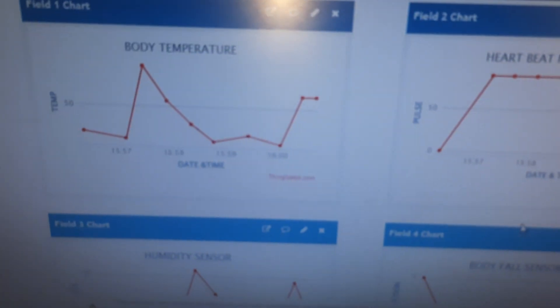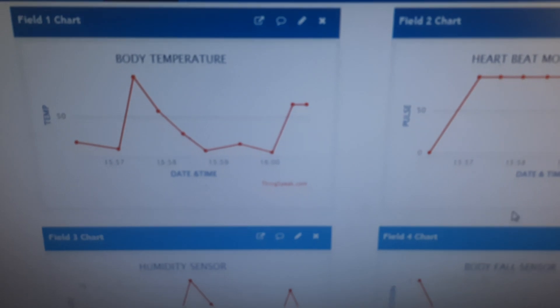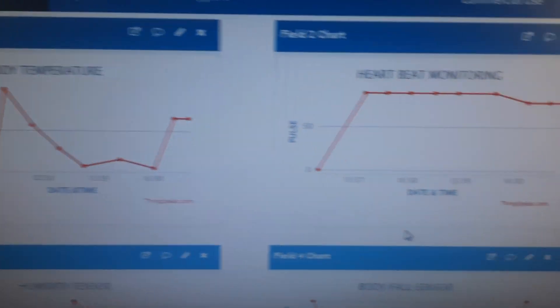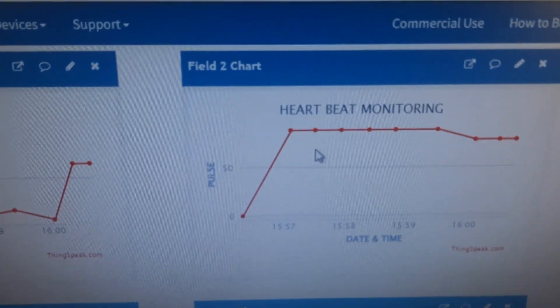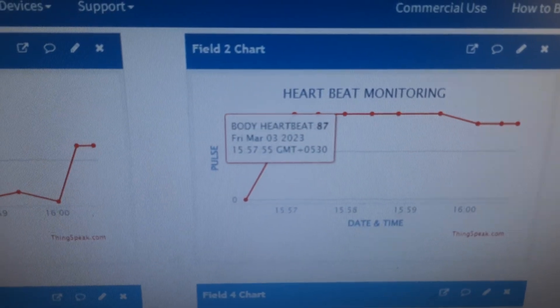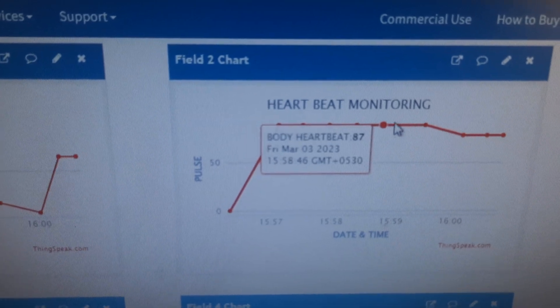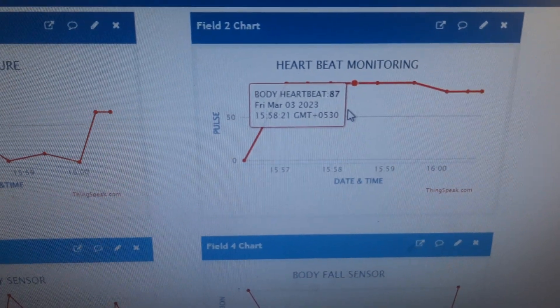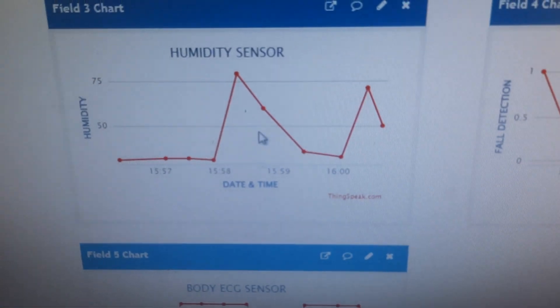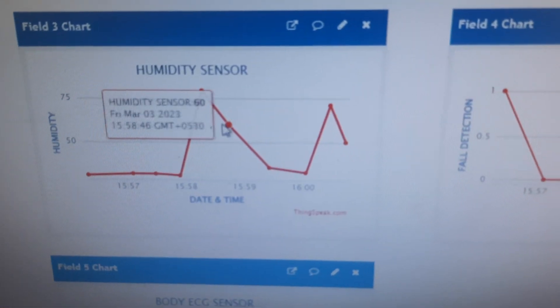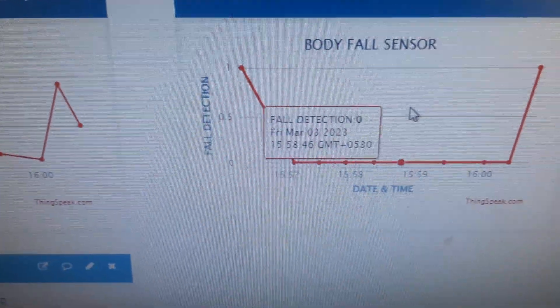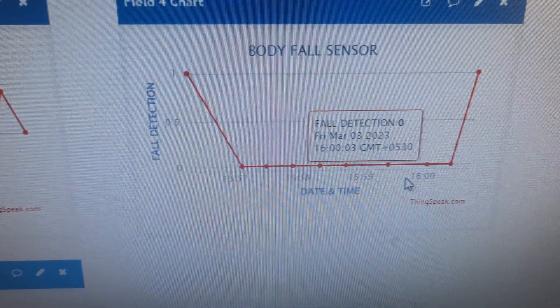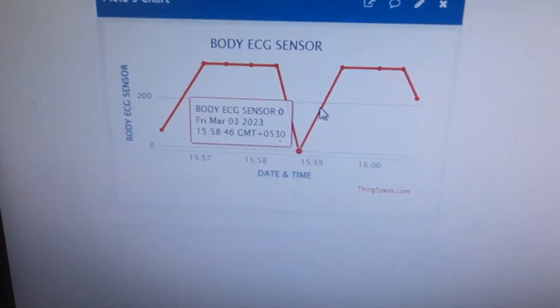We are getting the data onto the ThingSpeak cloud. LM35 temperature sensor, heartbeat sensor - we are getting the values like 87 for heartbeat value. Then humidity - whenever we are giving the humidity, the humidity value will come with date and time. Fall detection - whenever we are going to fall, it should be high. When there is no fall, it should be low. ECG values also came.